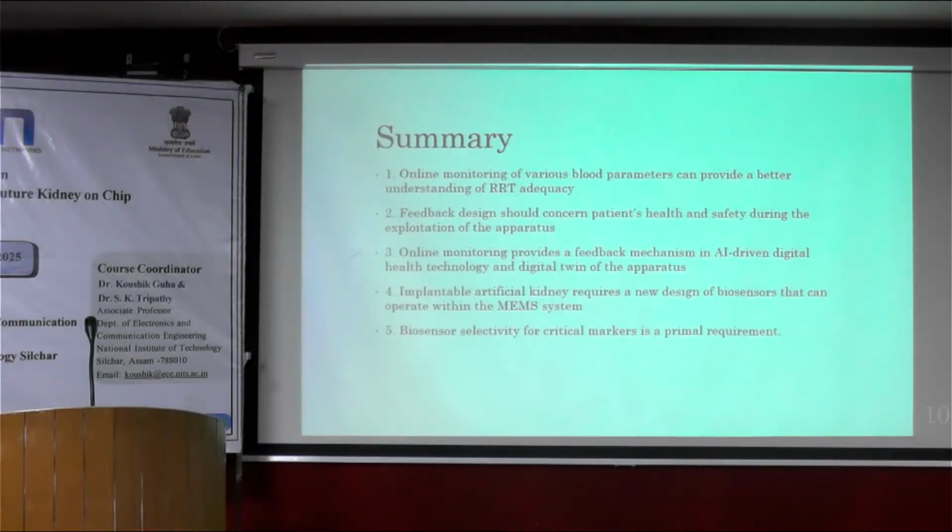That's also a very essential part, because we need to imitate the glomerular filtration rate that has to be at least 120 milliliters per minute, just like it happens in natural kidneys. That means that we need to provide proper flow monitoring, and this type of information can give us the idea if this parameter will change and what exact phenomena in the human organism will change this parameter.